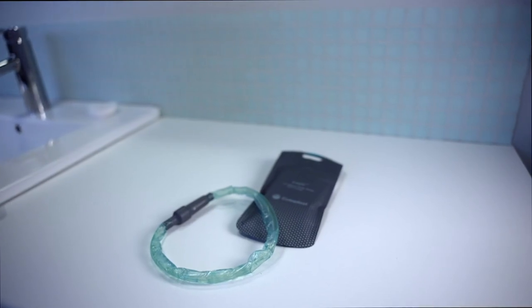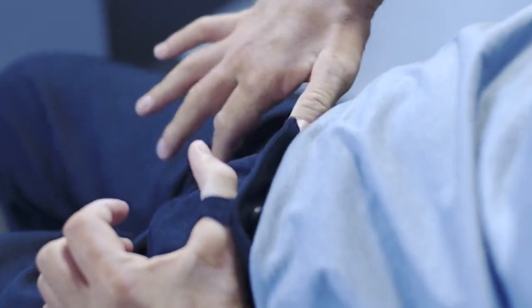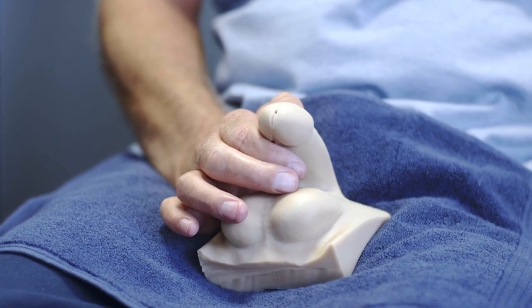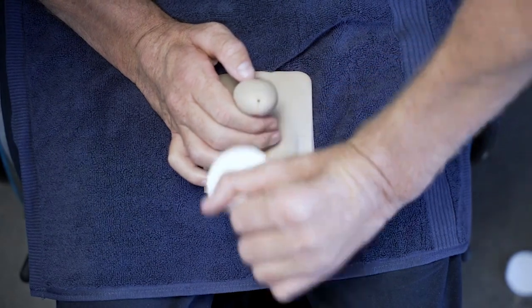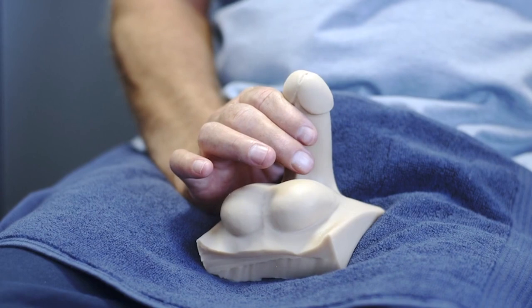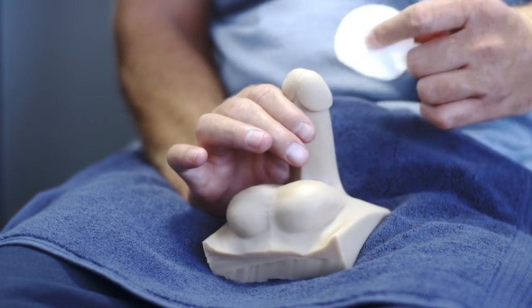Before you proceed, make sure you have all the equipment ready that you will need for the catheterization. Pull down your clothes to ensure free access during the process. To prevent pushing bacteria into the bladder when you catheterize, you must clean the area around the urethral opening as instructed by your healthcare professional. If present, gently pull the foreskin back to completely reveal the head of the penis, and start wiping from the urethra outwards.